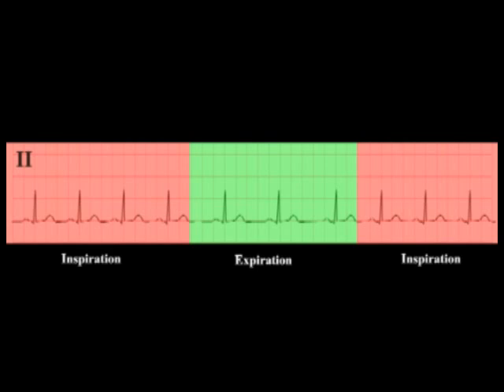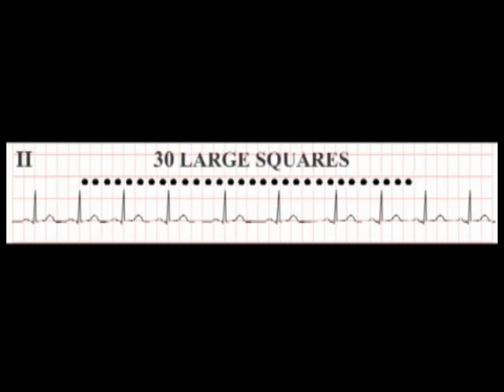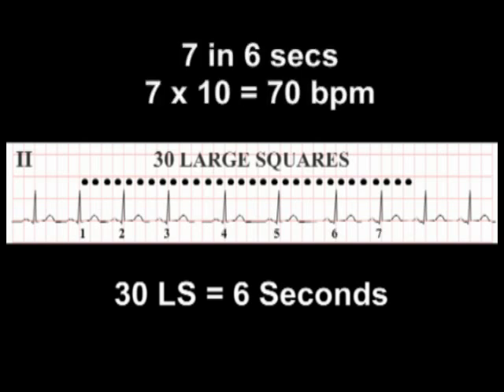We cannot use the RR interval technique to calculate heart rate when an irregular rhythm is present. Instead, count out 30 large squares. Remembering that 5 large squares equates to 1 second, 30 large squares corresponds to 6 seconds. Count the number of R waves in these 30 squares — in this case there are 7. Seven beats in 6 seconds gives a heart rate of 70 beats per minute.